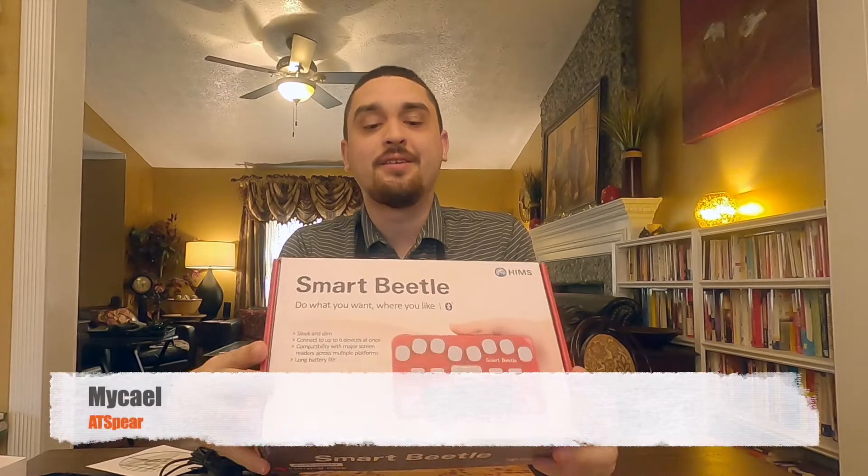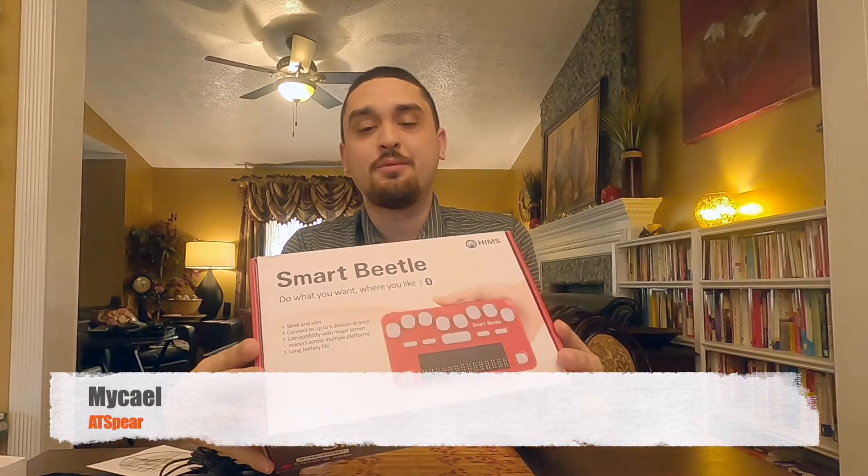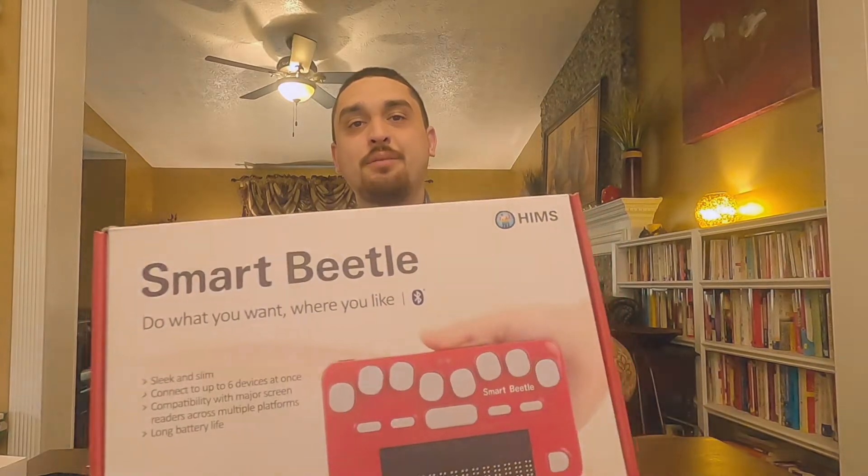Hi, this is Michael, and today I'm going to show you the HIMS Smart Beetle Braille Display.